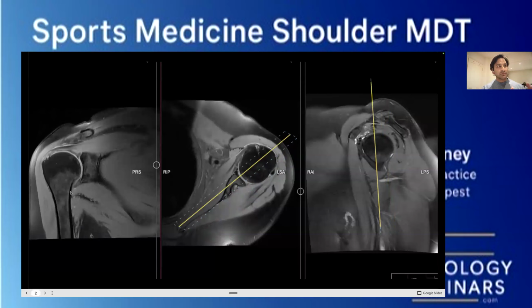Now, I'm going to use this opportunity as we look at the person front on, because we all know what people look like from front on rather than upside down and the rest of it. I want to try and identify certain bits of anatomy or certain things that this MRI scan is showing. So this MRI scan shows you something very specific, right? It may not be obvious at first, but you'll notice that the subcutaneous fat, which is underneath your skin, doesn't matter how much you work out, you're always going to have a bit of fat underneath your skin, looks a bit dark. And then you can see certain areas that look a bit bright.